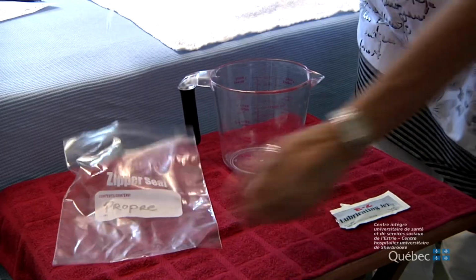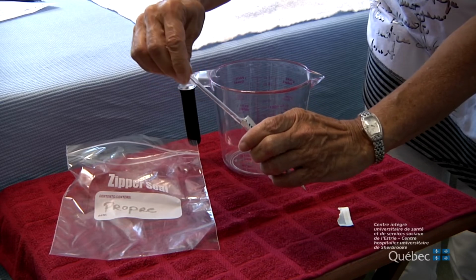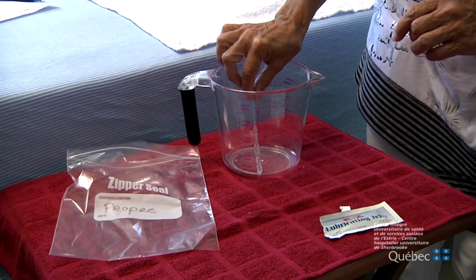Liberally apply lubricant to the rounded end of the catheter with the 2 openings. It is important that you do not touch this part of the catheter with your fingers. Put the catheter in the measuring cup. Remove your panties and get settled comfortably. If you have decided to use the bed, place the towel under your buttocks.